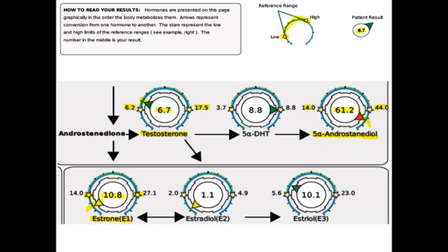Within the way we're plotting them here, when you see a result where the dial is pointing straight towards the middle top, that represents essentially exactly average within the population. As you move to the left from that, you'd be below average until you're at a point where you're out of the reference range, and then you'd be designated as low. And likewise, as you move to the right, you'd be on the higher part of normal, and then as you get outside the reference range, the result would be classified as elevated.